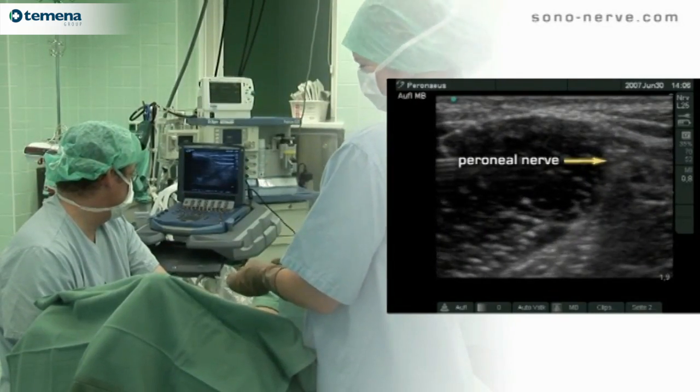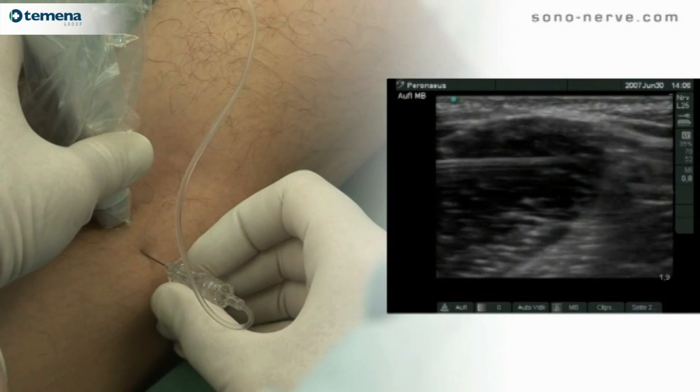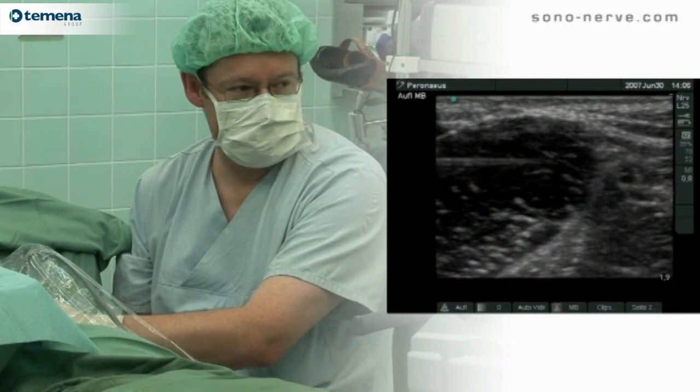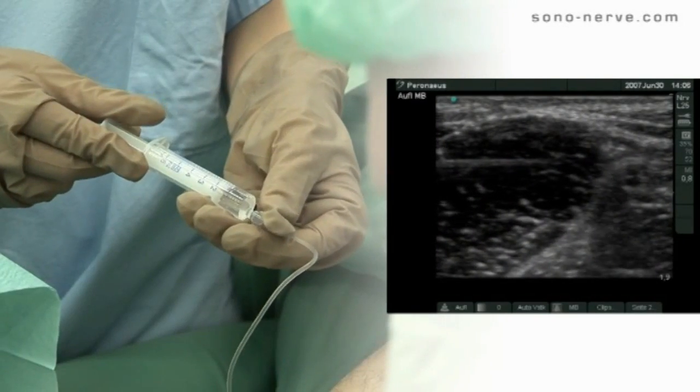Seen very clearly in this ultrasound video clip is the typical reverberation artifact behind the needle. The common peroneal nerve is typical for a peripheral nerve and is highly hyper-echogenic.